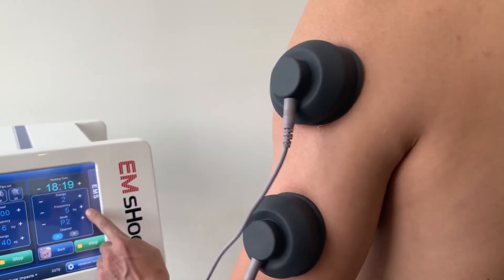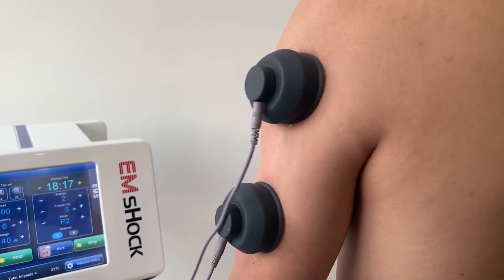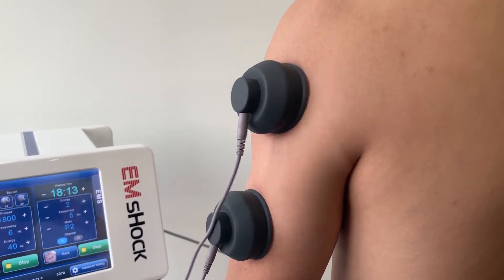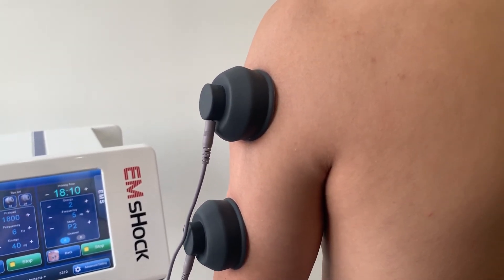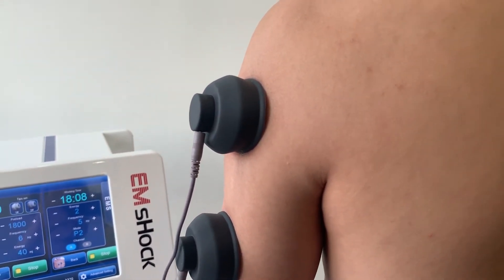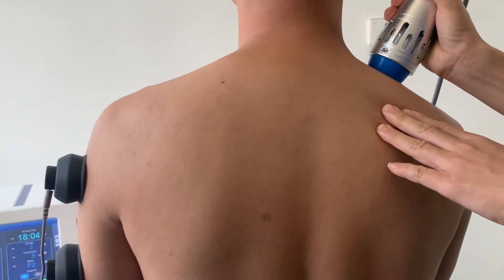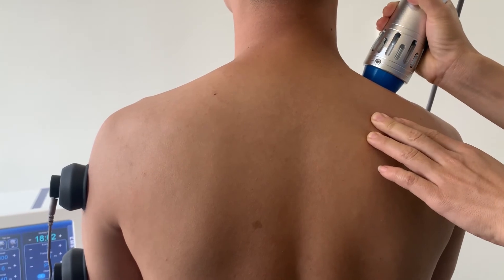How do we define the two technologies? According to scientific studies, EMS is more targeted to muscle stimulation and muscle relaxation. Shock wave stimulates deeper, to repair deep muscle and tendon-bone reactions, as well as muscle patterns.